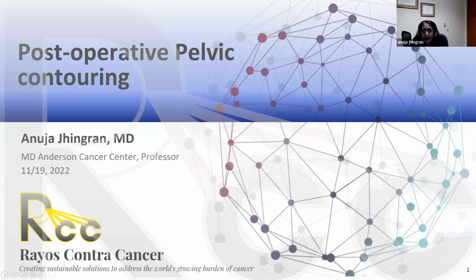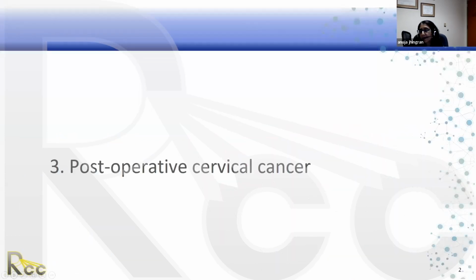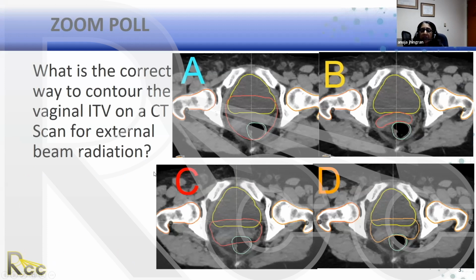So today we're going to be talking about post-operative pelvic contouring. And key is we're going to actually be talking about both cervical cancer and endometrial cancer. Sorry about that. So let's do our first question.